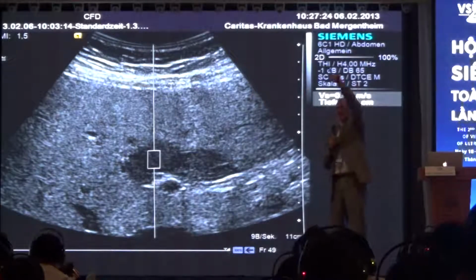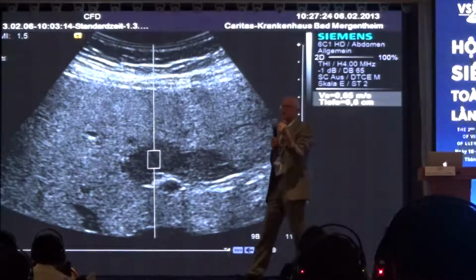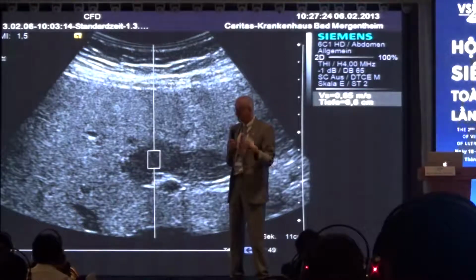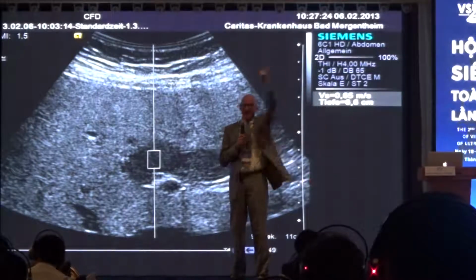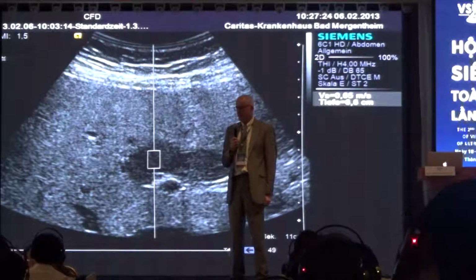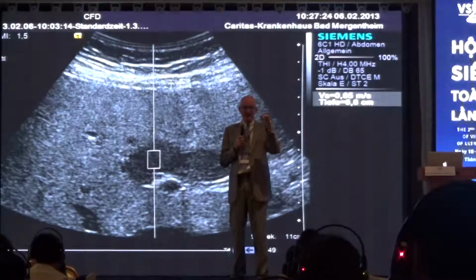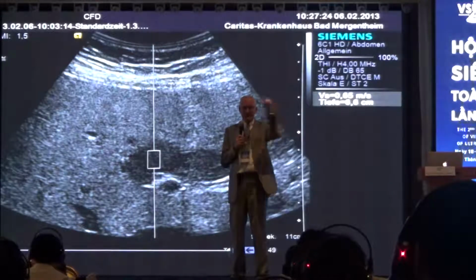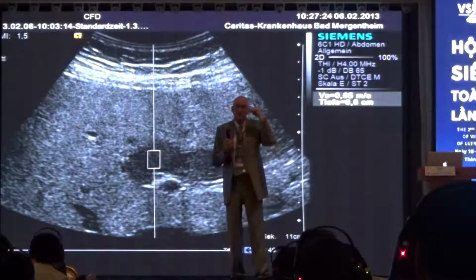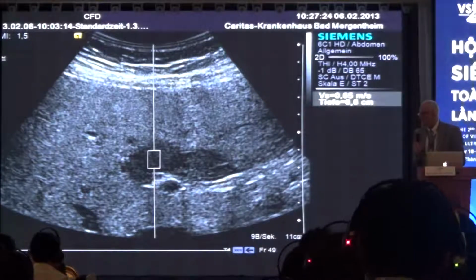Cholangiocellular carcinoma and metastasis generally have the highest values. Focal nodular hyperplasia, FNH, is a local cirrhosis and displays very stiff values as well. So there's an overlap of benign and malignant lesions. But I'm not so much interested in the measurement of shear wave velocity within the lesion. In almost all lesions, I'm interested in how the surrounding parenchyma is. So shear wave elastography is very useful for the determination of the surrounding liver parenchyma.